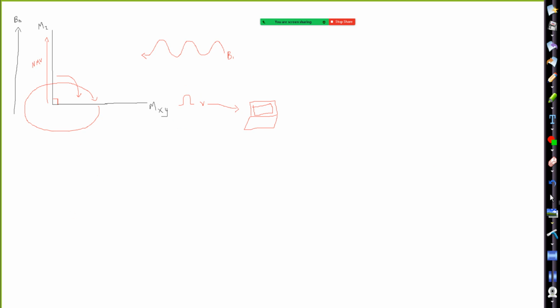So now let's think about having that vector in the transverse plane. Okay, so I'm going to draw my two axes again. Now we have that vector in the transverse plane, which is desired for signal reasons. Okay? But we have vectors for all different tissues.